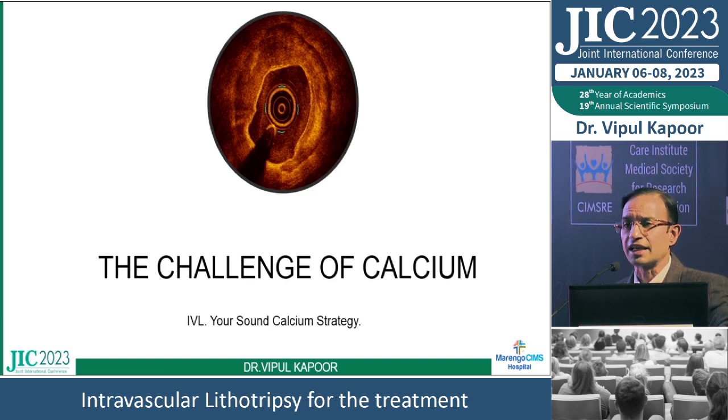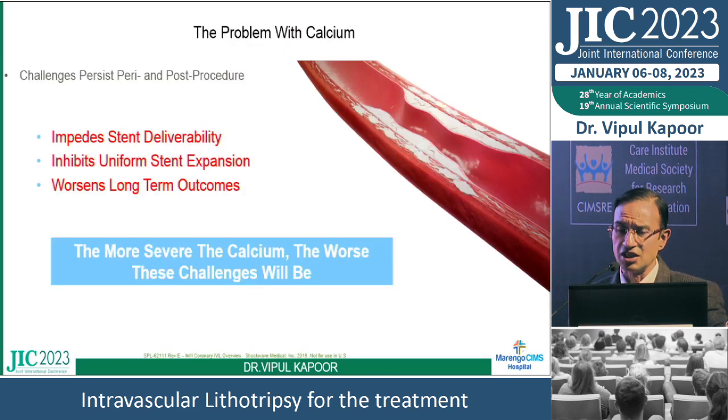It was pretty simple, just a slight extension of the capability of an interventional cardiologist. It was so easy to master and so easy to perform, with such good results and such minimal side effects, that it just took over. It has now become a mainstay of treating calcific coronary artery disease. So I would say it's a sound calcium strategy. It is all about sound, and it is also sound in other ways. So it's a pun, and you could see that it makes sense.